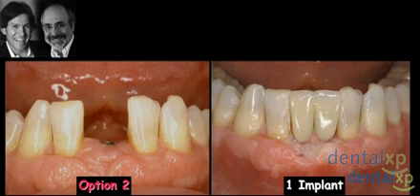And really, down the center is one issue, but really what you did there for me was to put it lingual, allowing me to have all that space to play prosthetically. If you'd gone down the middle of the ridge there, we would really have been in trouble.